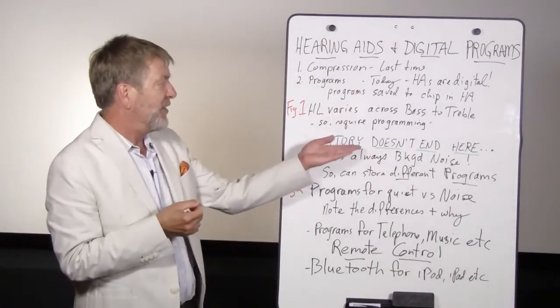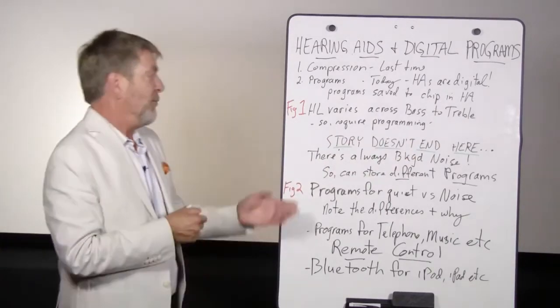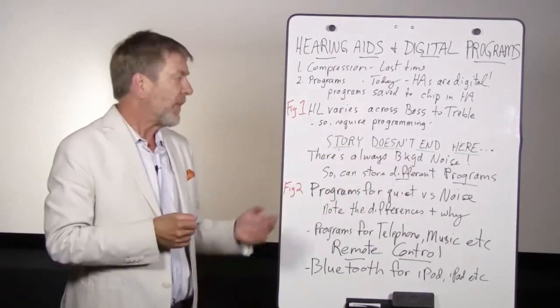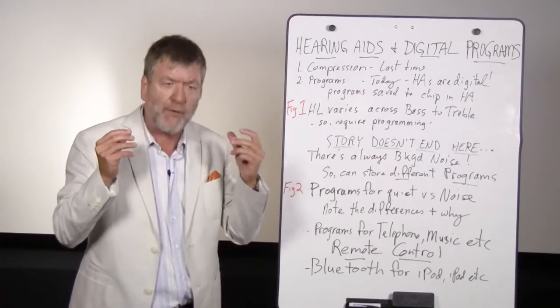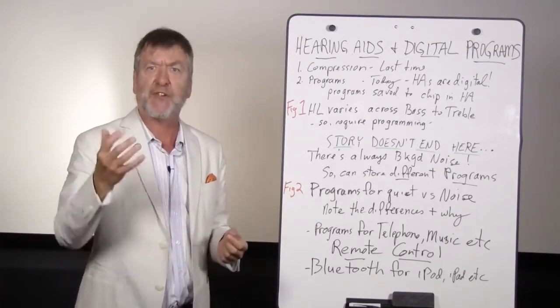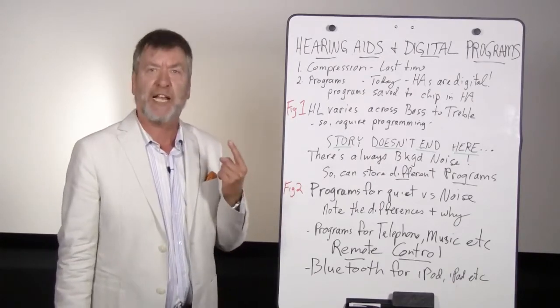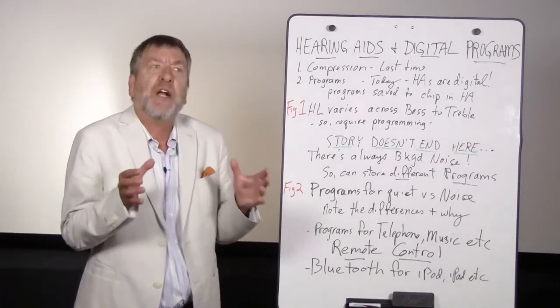So the story doesn't quite end here, though. There's more to it, because there's always background noise. Listening to speech in background noise is one of the hardest things for someone with hearing loss. It's even hard for people with normal hearing. It remains the number one complaint of people with hearing loss who wear hearing aids. How are we addressing this?